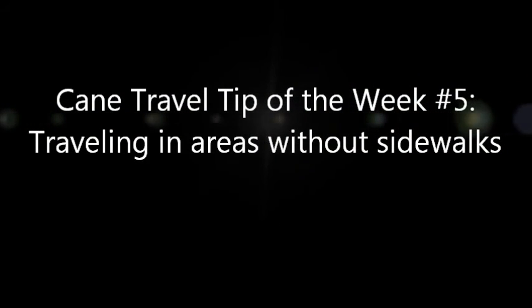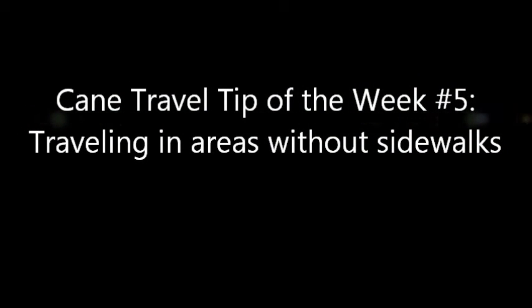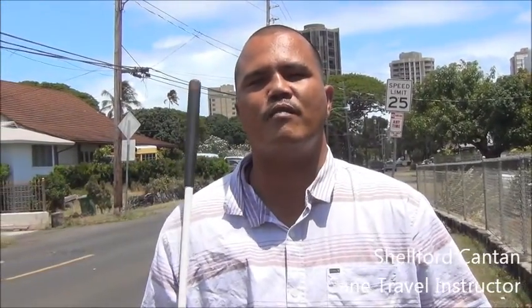Cane travel tip of the week number 5, traveling in areas without sidewalks. Okay, aloha everybody, welcome back again. So this week, we're gonna learn how to travel in areas with no sidewalks. Everybody wondering, how does a blind person travel with no sidewalks?